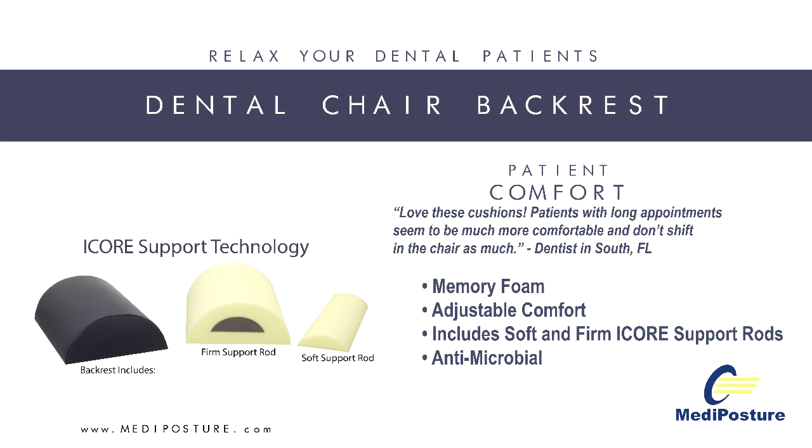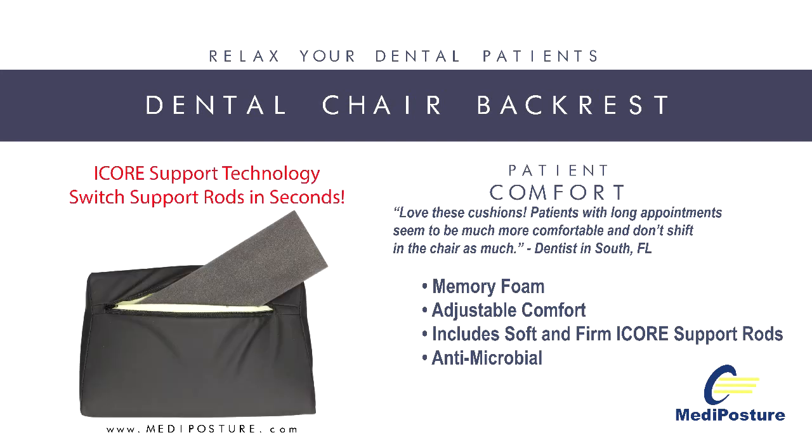This dental backrest features I-Core technology, a concept that allows users to define the level of support by quickly inserting a soft or firm inner support core through a zippered access on the back. The I-Core dental backrest by Metaposture accommodates all patients and retrofits to any dental chair.